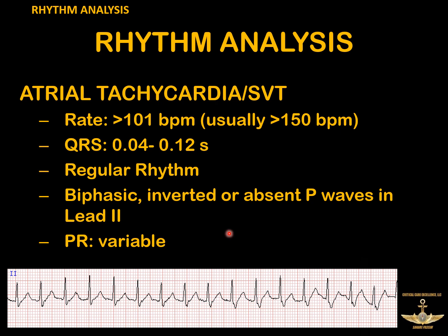And this is a rhythm you almost certainly see on testing. You almost certainly see this when you do ACLS, where they will talk about this rhythm and the distinction between stable and unstable patients as far as treatment.